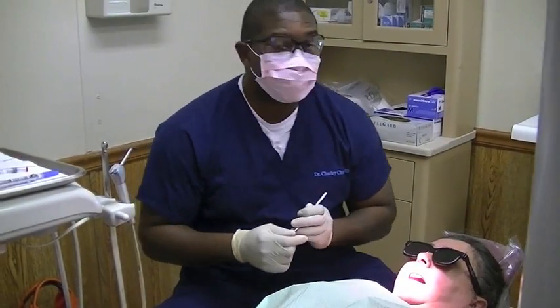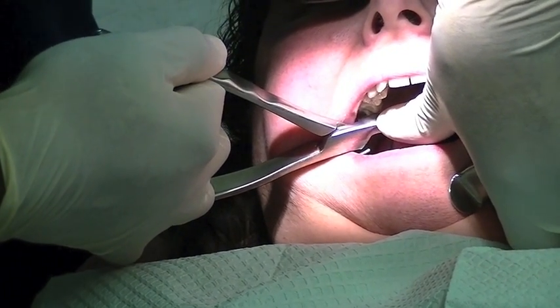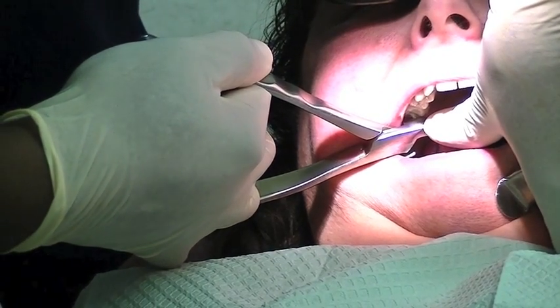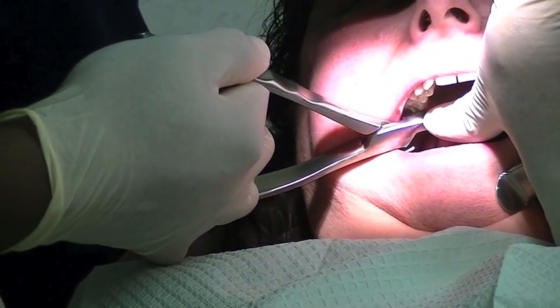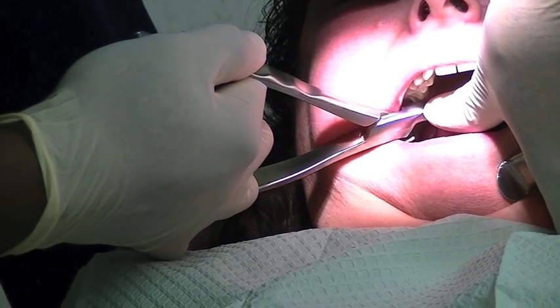This next procedure will be extracting tooth number 31. My left hand, just to hold it in position because it is slipping, just due to rotation-limited opening. And just waiting.